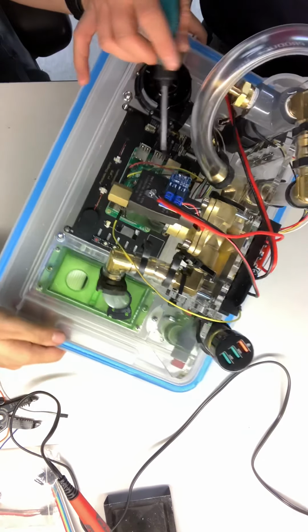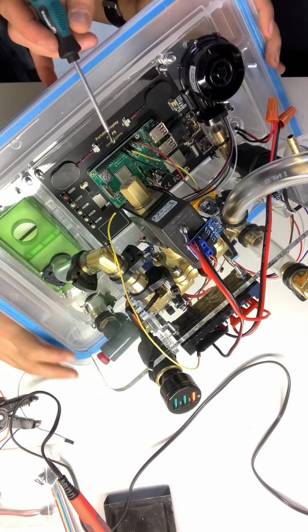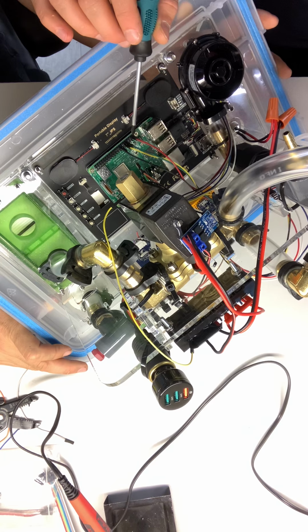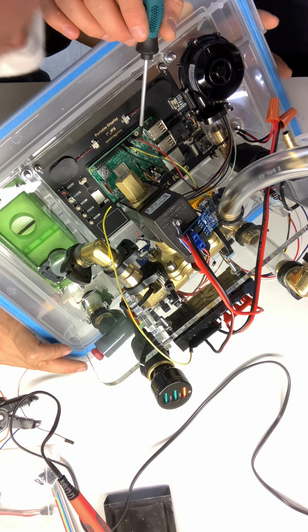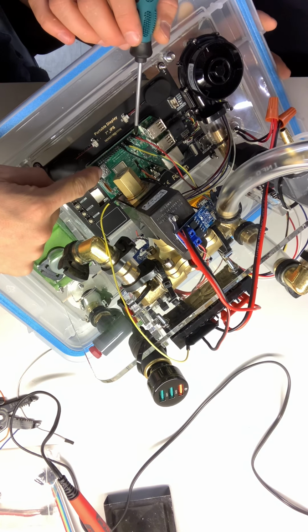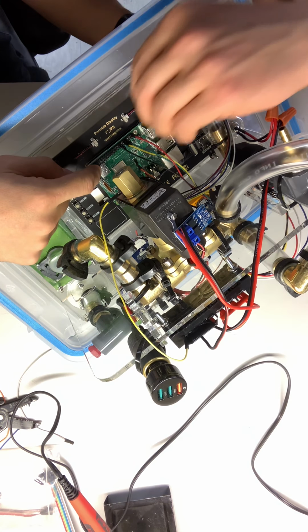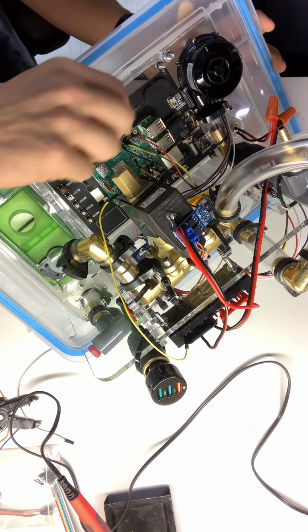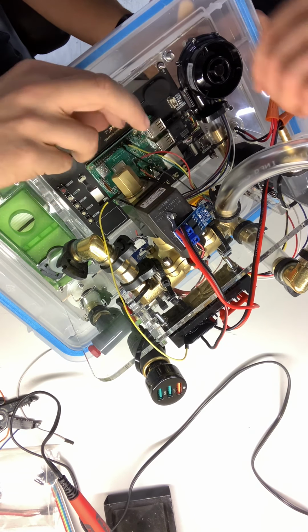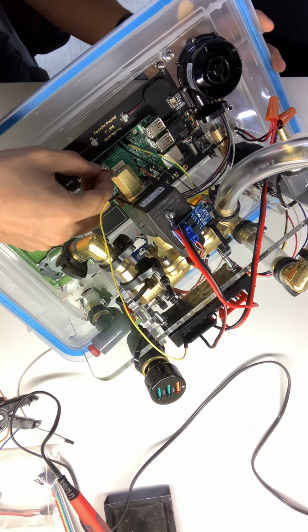And then on the Pi side, coming from our level shifter, red is going into this pin. I don't know the pin numbering for the Pi, but it's the far corner here. Is that right? This diagram looks different to me. It should be that pin. Yes, you're correct. I'm just saying this is too short. No, we'll make it. Okay, fine. You're right. This one, right?